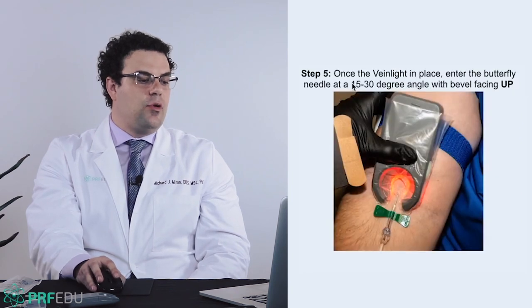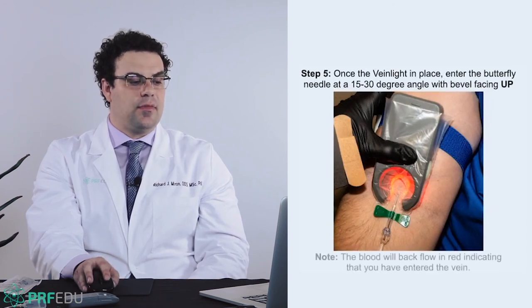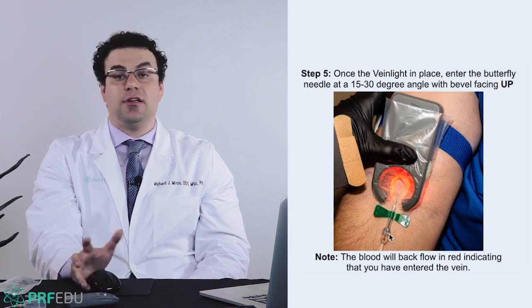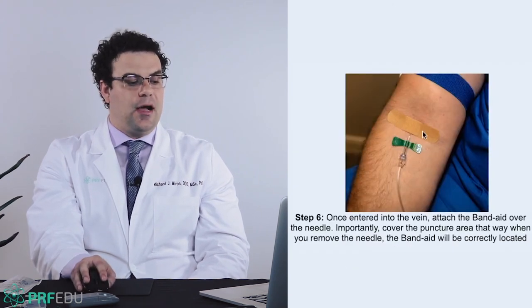Step five, you're going to enter, okay, the butterfly needle, bevel facing up, 15 to 30 degrees, okay? When you enter the vein, you're going to see backflow. So you're going to see a little bit of red blood there, and that's going to let you know that you've entered the vein. Okay, tie the Band-Aid over top afterwards.